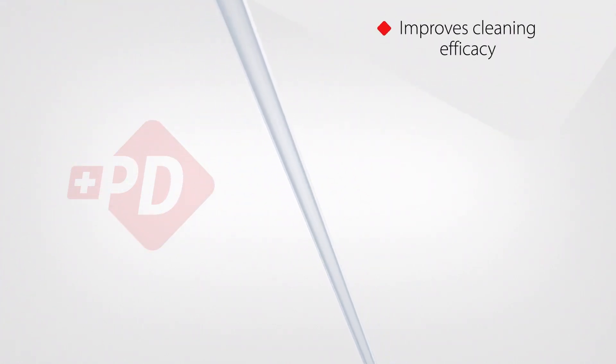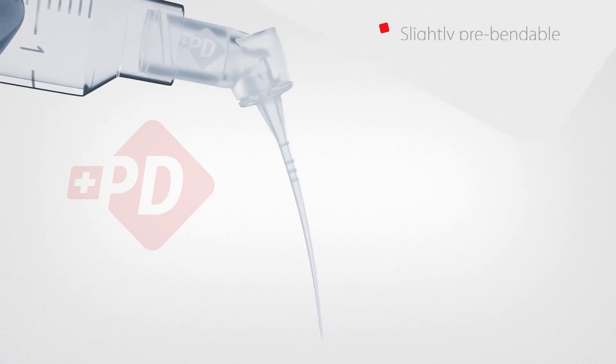The unique closed-ended two-side vent needle design delivers solutions as close to the apex as possible. The horizontal flow and the specific taper increase the shear stress effect in the entire root canal system for more efficient cleaning results.